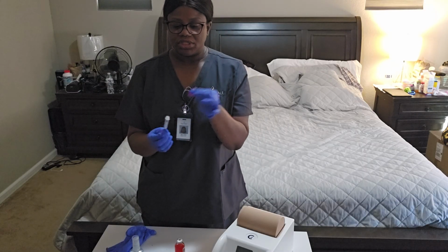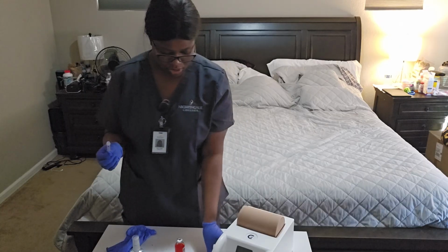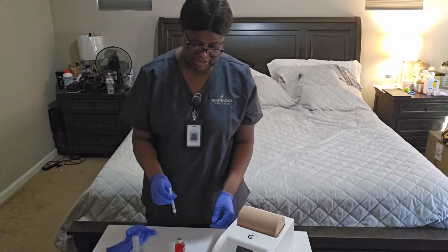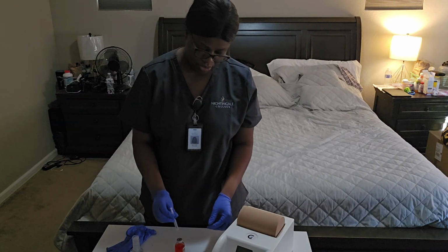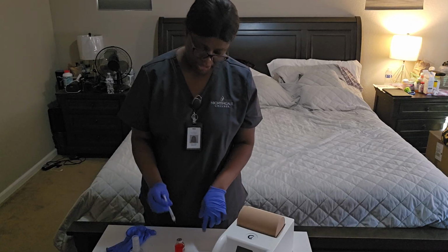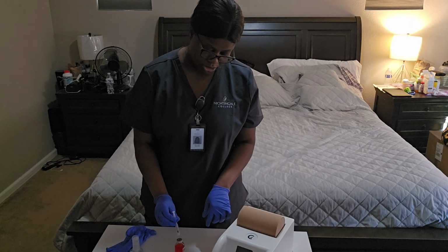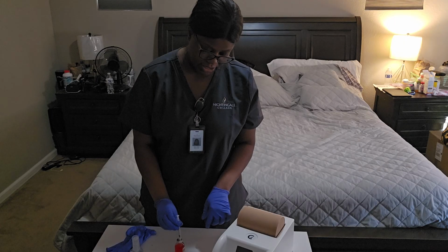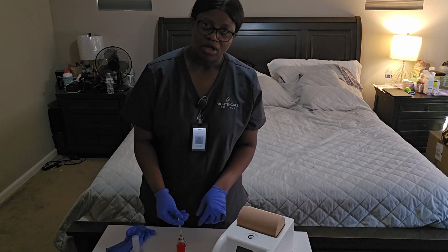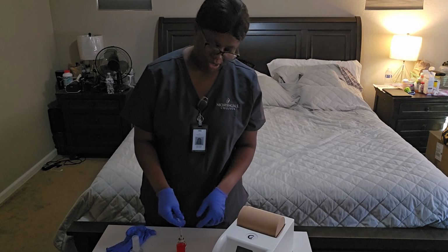I'm going to gently take off the top and put it by the side. By this time everything is dried already, so I'm going to gently insert it inside the vial and push in the 0.1 ml of air.